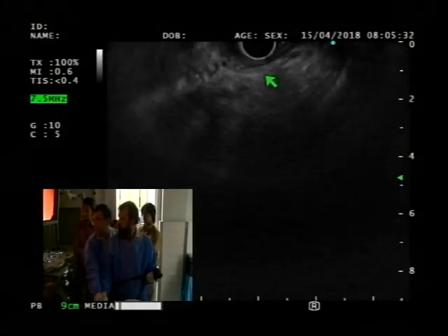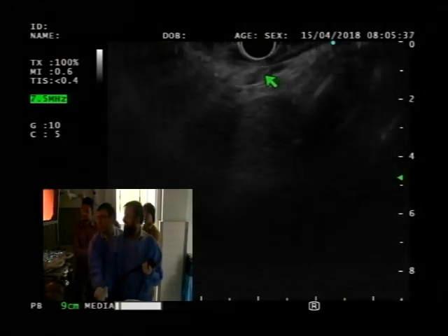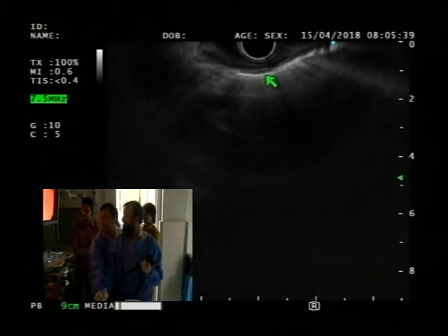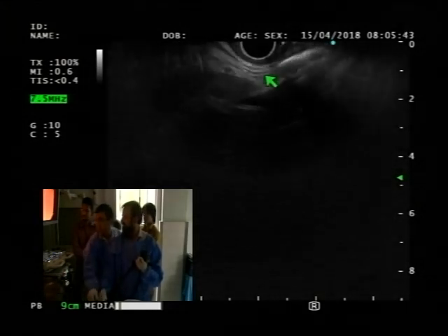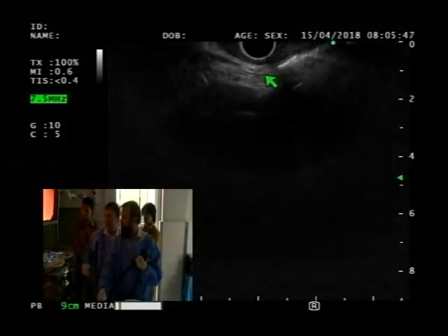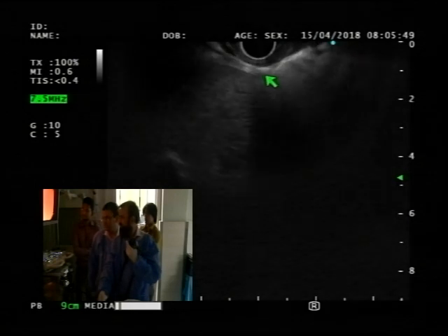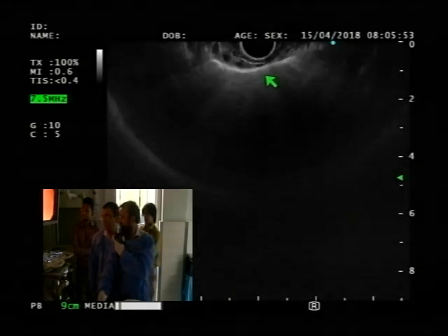Okay. You're just sitting there, not doing anything, so we have to find the aorta again. Okay? If you are lost, left lobe of the liver there. Now rotate it to the right. Rotate it to the right. Good job. Keep going, keep going, keep going. Let's find the aorta again.